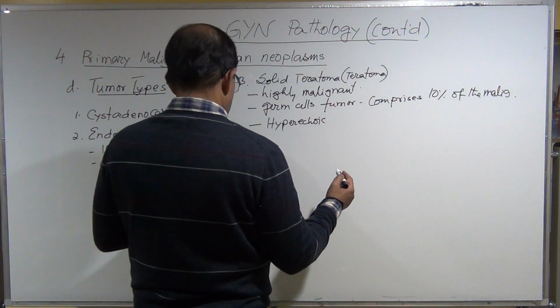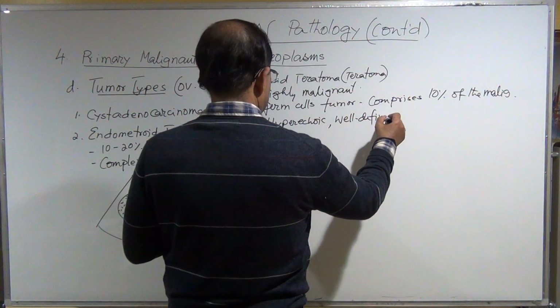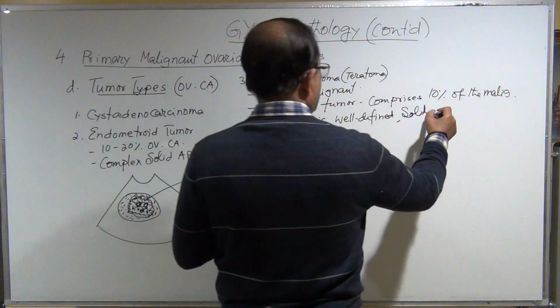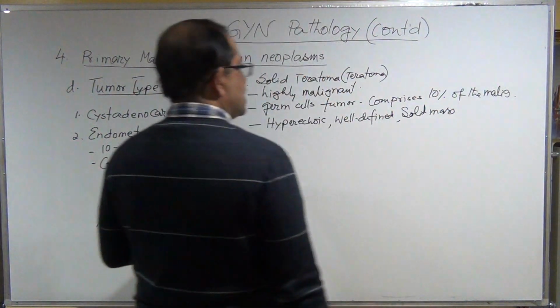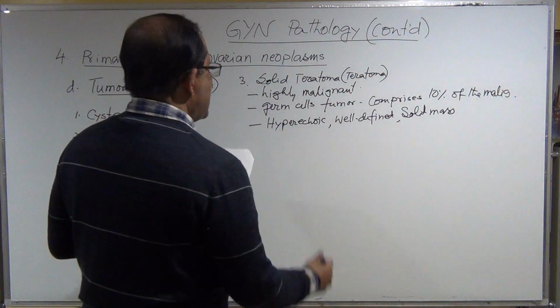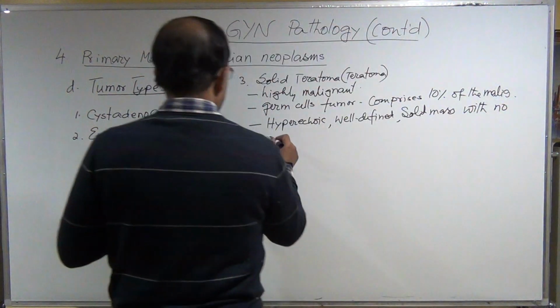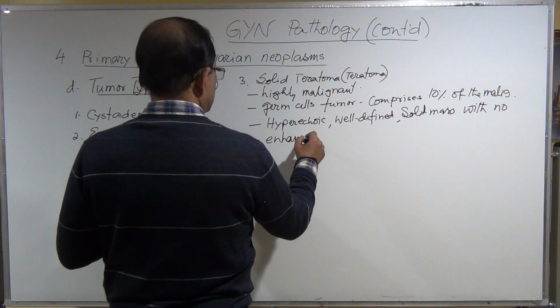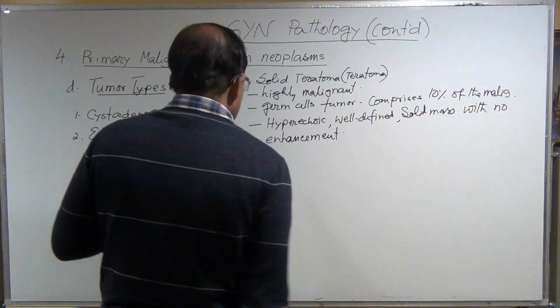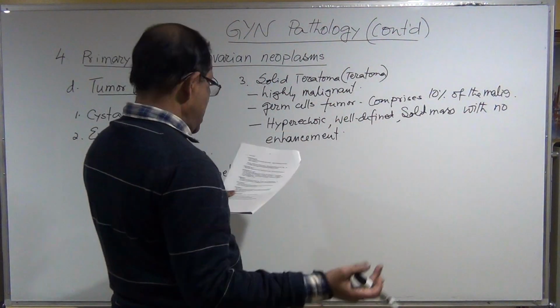Hyperechoic, well defined solid mass with no enhancement, because there is no liquid part here, and rather it can make the shadowing.